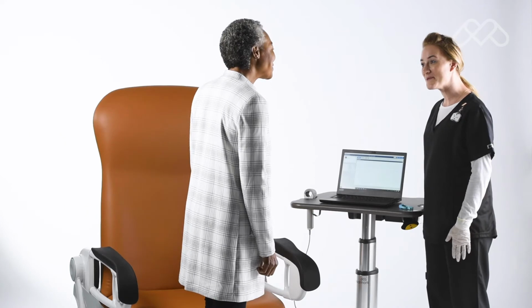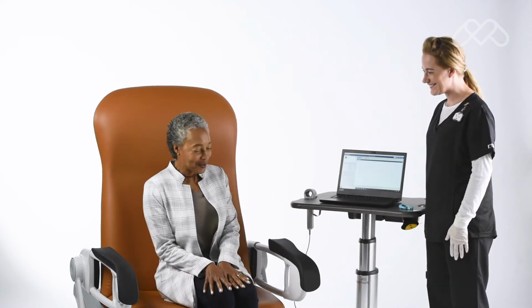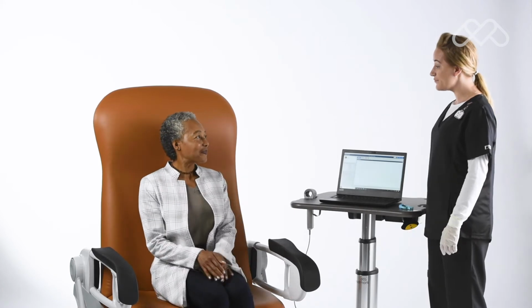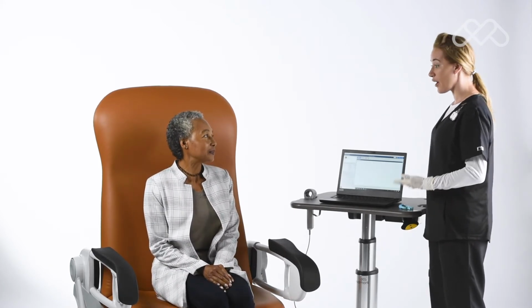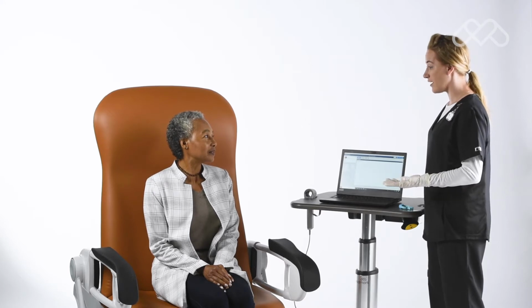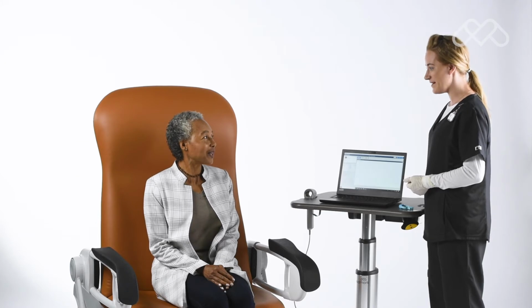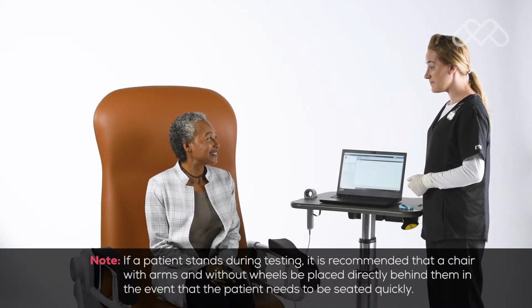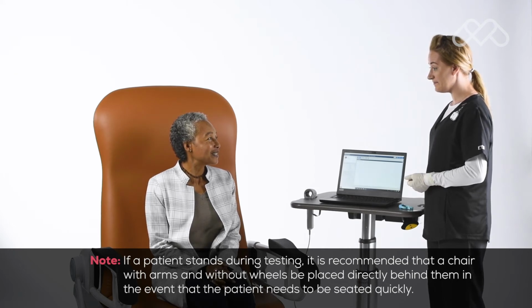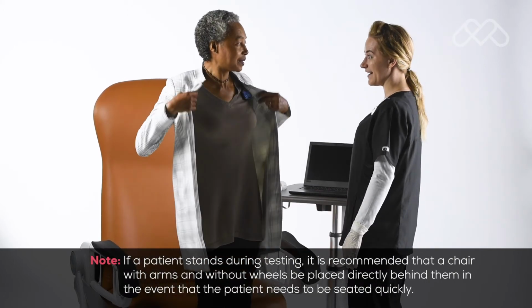A sitting position is recommended during testing, as it may be safer for the patient if they experience syncope or dizziness while performing the forced expiratory maneuver. If prior testing took place with the patient standing, you can perform a new test with them sitting, but make a note of the change. If a patient stands during testing, it is recommended that a chair with arms and without wheels be placed directly behind them in the event that the patient needs to be seated quickly.